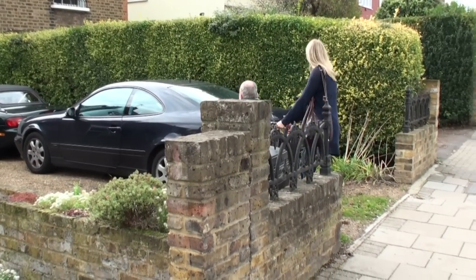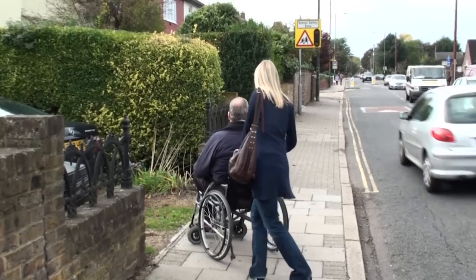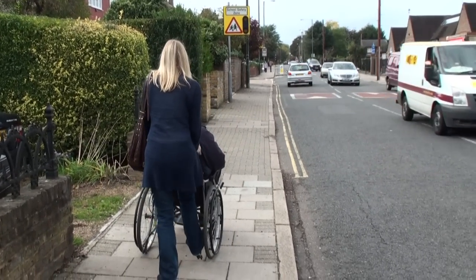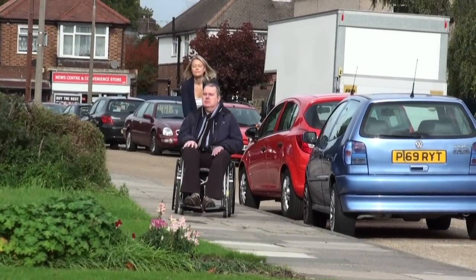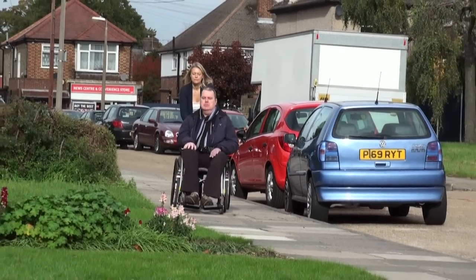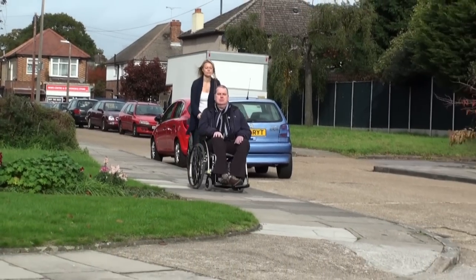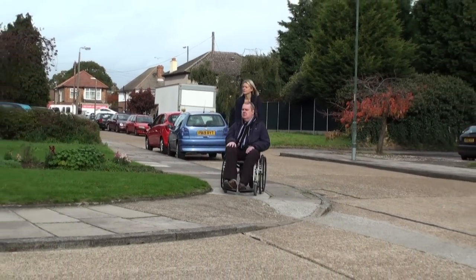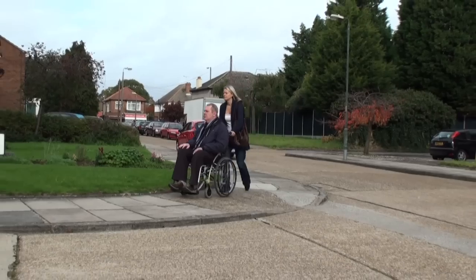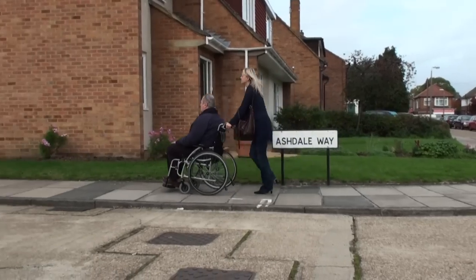Try to plan your journey, especially if you are considering public transport. Will there be stairs or wheelchair access at the end? Will there be a disabled toilet if needed? Also, know your limits — don't plan a long journey unless you have enough stamina to push them back. Remember to pace yourself, leave plenty of time for your journey, and take a break if needed along the way.